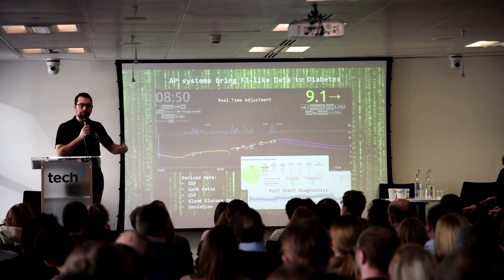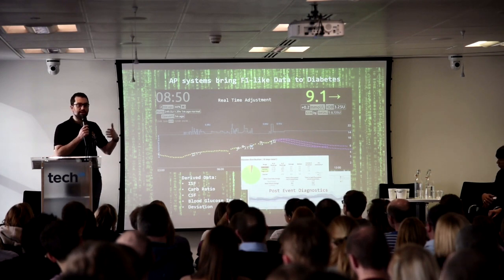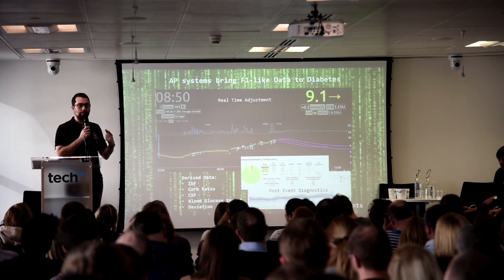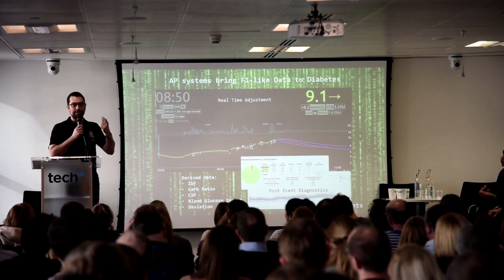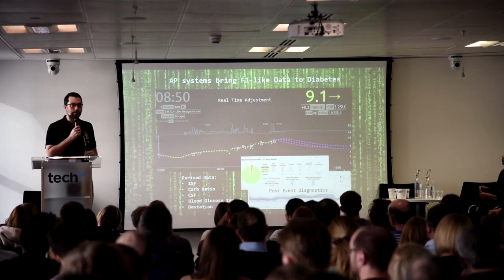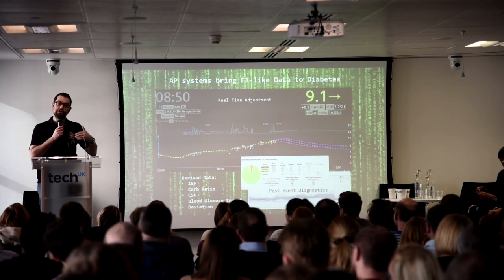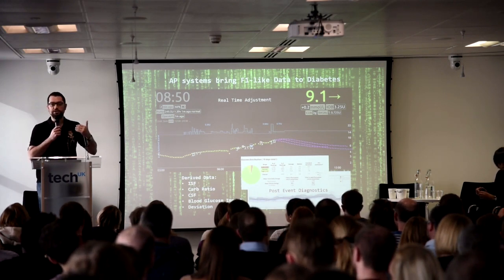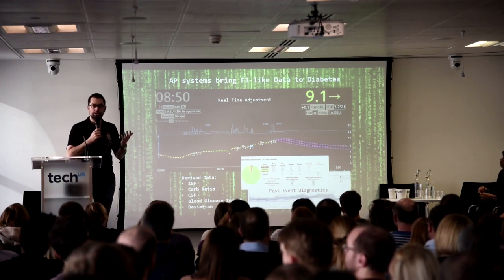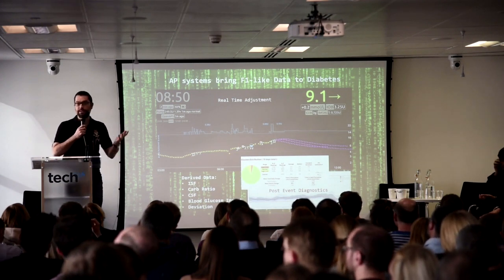So, during the course of the day, OpenAPS calculates my insulin sensitivity and adjusts what's going on in terms of how it adjusts my basal rates and what carb ratios to use when I tell it I'm eating in order to better fit and better manage what's going on. It also has other factors like blood glucose impact and deviation that it uses to determine what it's going to do next. So if we're creating all this data, it gives us a massive opportunity to do something that people haven't done before because they simply didn't have the data.